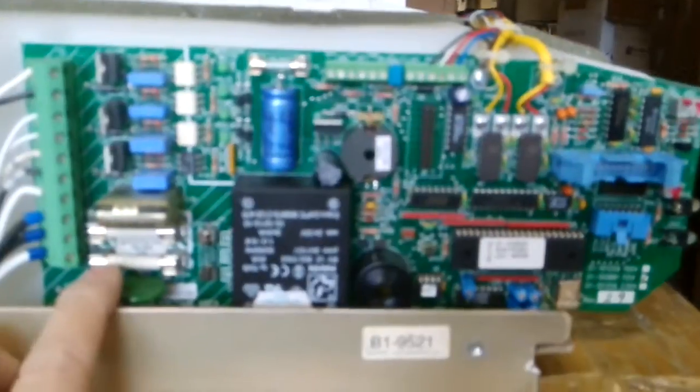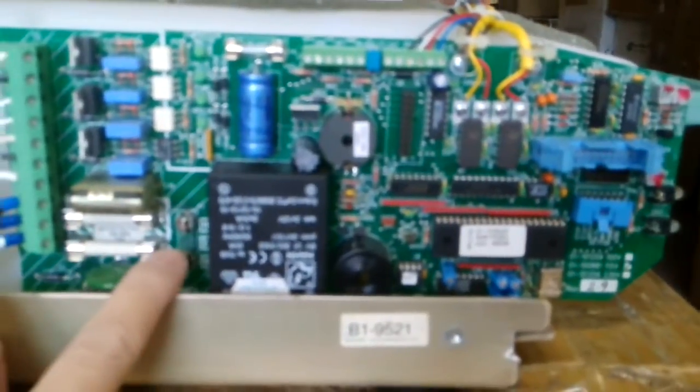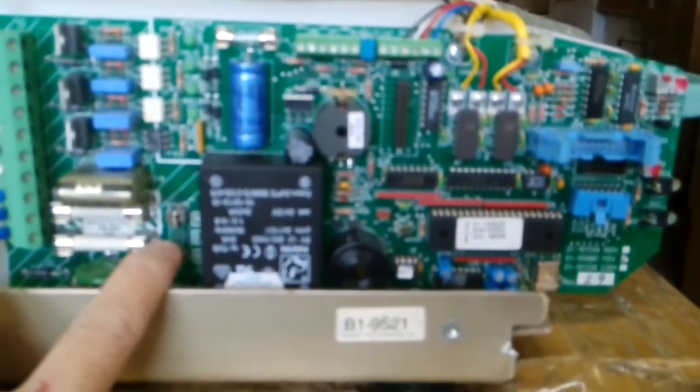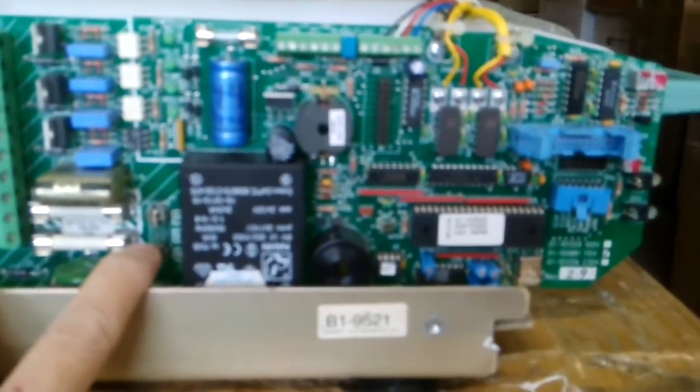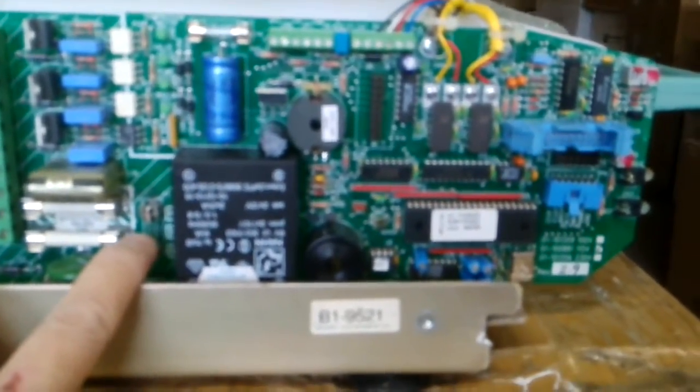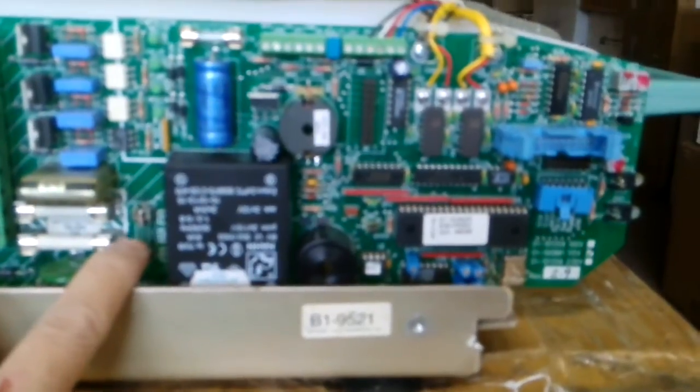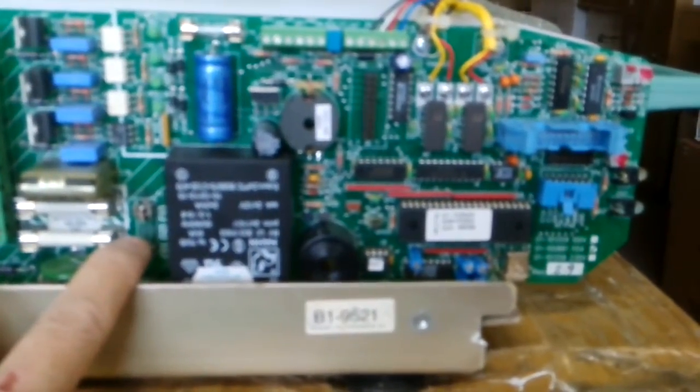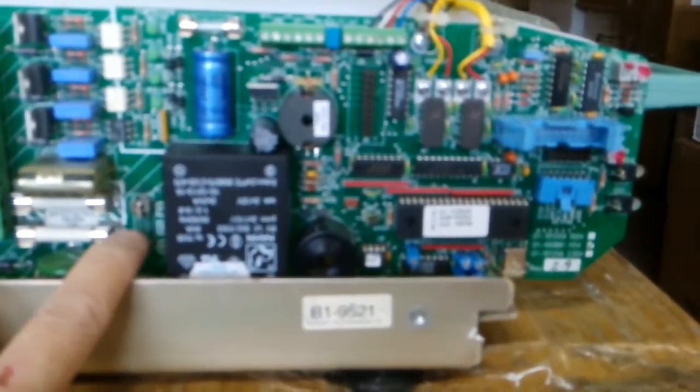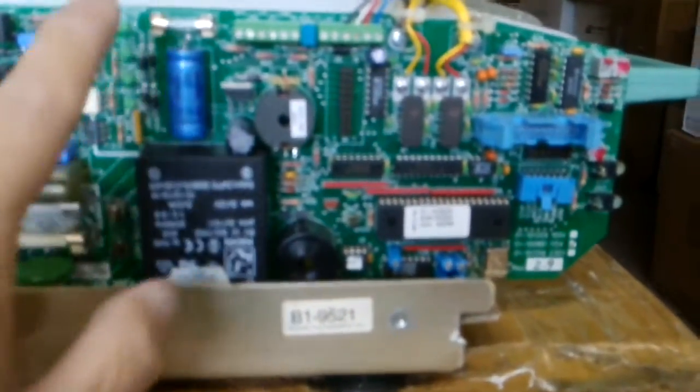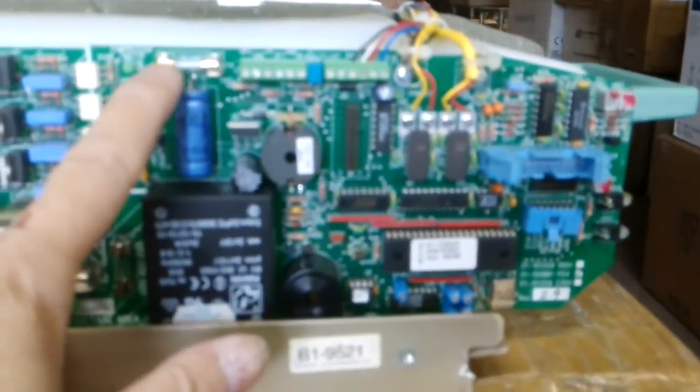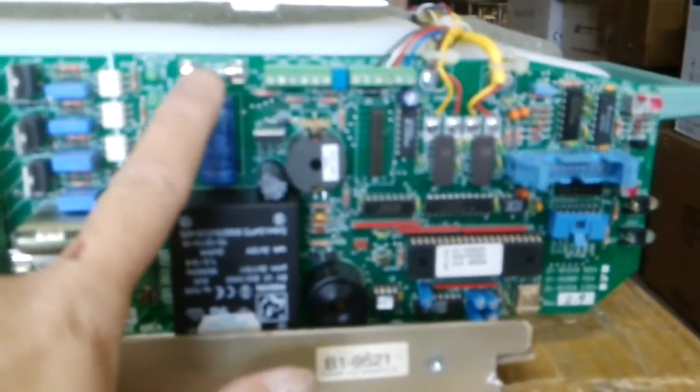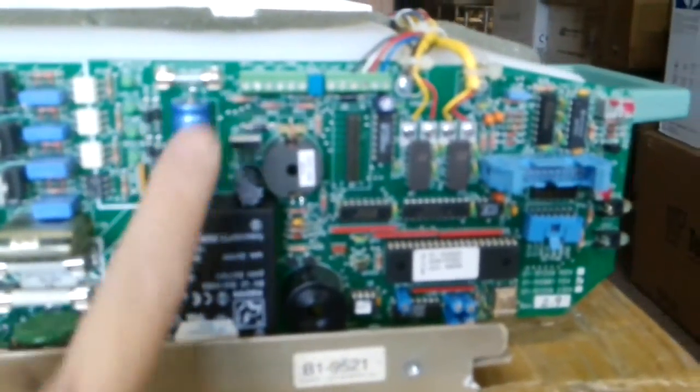These two are main fuses for the power. This fuse is for the air pump - it's a 2 amp fast fuse. And this is a 0.25 amp, a quarter amp fuse.